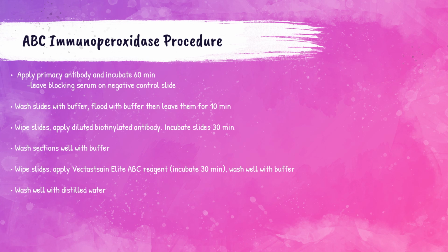After 30 minutes of that incubation with that Vectastain Elite ABC reagent, it should be washed well with buffer and then washed well with distilled water.